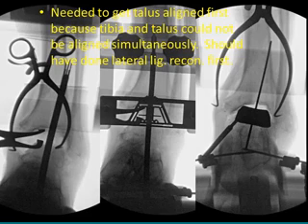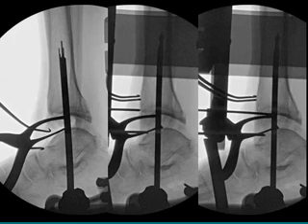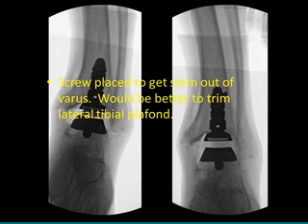And again, here I've learned to do the lateral reconstruction first when the tibial talar space opens up so widely on that far left. On the lateral view, it's not such a big deal. It's much easier. But again, you get the sense that that tibial talar joint space is just too wide. And I should have done the ligament reconstruction first, and I would have been able to swing this back into position.